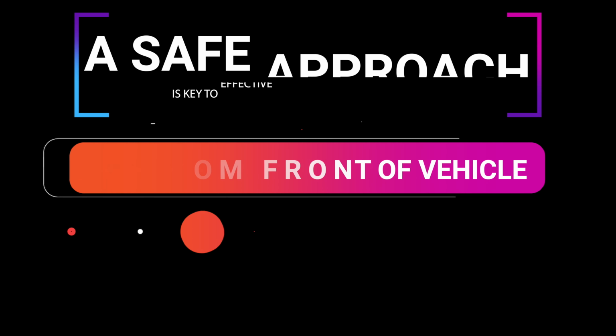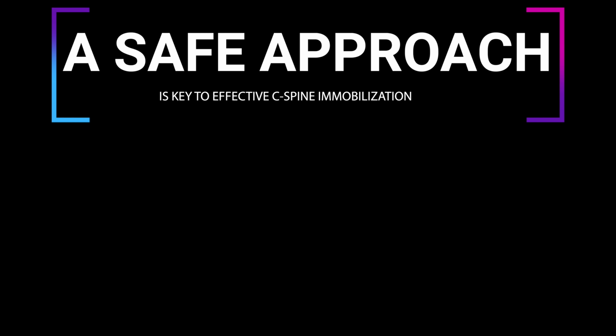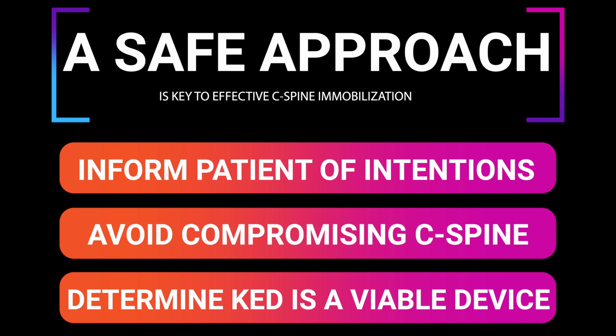Approach your patient from the front of the vehicle, but do not put yourself in the path of the vehicle, and instruct the patient not to move their head. If you approach the patient from the side of the vehicle, they will most likely turn their head in order to see who's addressing them.